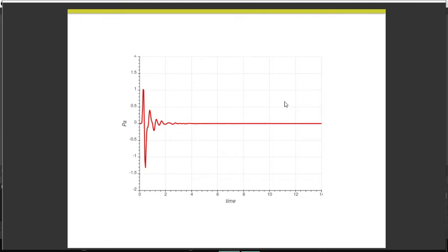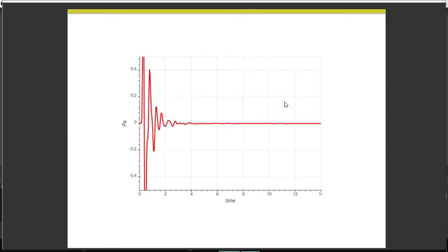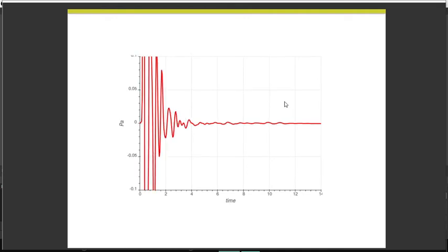So what I've done for this is prepare some little graphics. This is a measurement just in my ear canal, and that is the ear canal response to the stimulus. Time is along the bottom axis, pressure on the left hand side, and I'm going to keep turning the gain up so that we can get that bigger and bigger. Each time I change slides, the stimulus gets bigger, so we're amplifying it up, and by this point, the stimulus is way off the top of the screen.